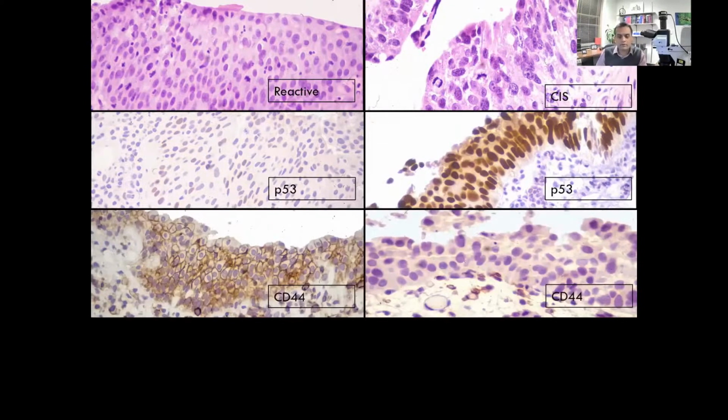And we know that in reactive proliferation, CD44 is supposed to stain the full thickness of the urothelium. And that's exactly what it's doing in this case. Whereas in contrast, in CIS, you would see either no staining of CD44 or only a basal layer staining, right? And that's exactly what's happening here.